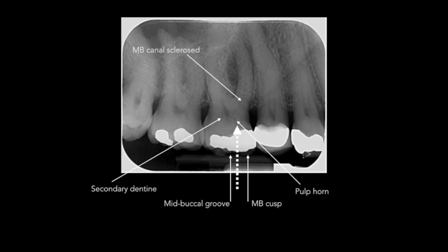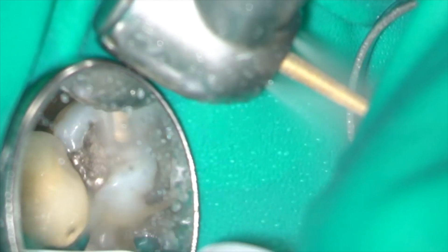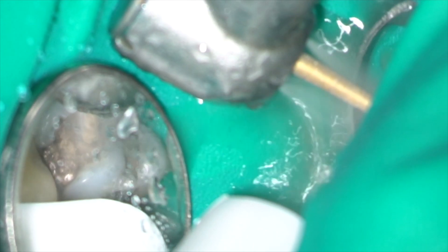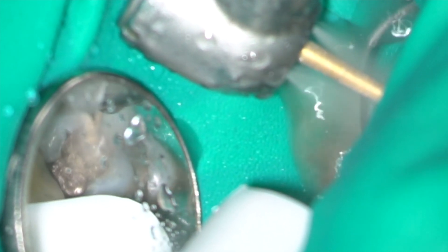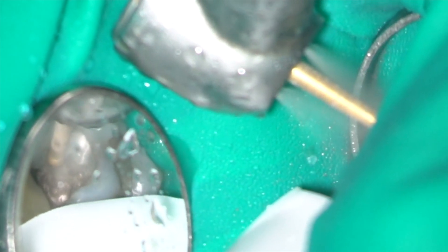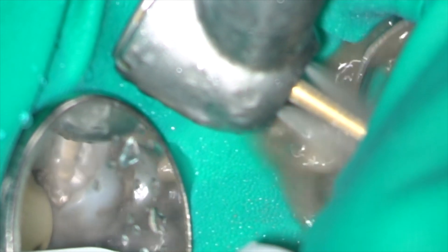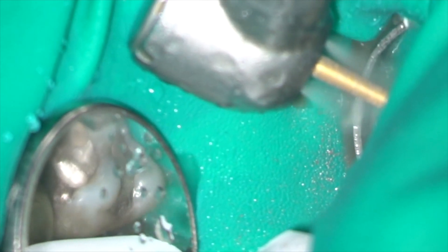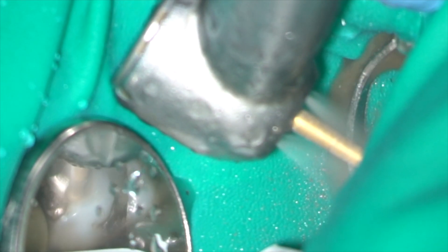In this case I'm going to use a point between the mesial buccal cusp tip and the mid buccal groove. Of course there's another way to make things a lot easier and that's to remove the entire restoration, and that's exactly what I did in the first molar. So here I am removing the amalgam restoration with a diamond burr.